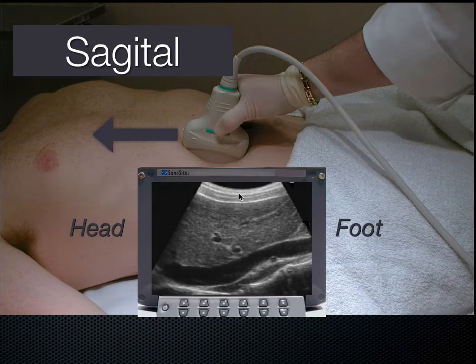As I go deeper or posterior into the body, I finally arrive at the inferior vena cava. It's located underneath the liver. And I can see this is blood draining towards the right atrium of the heart, which is up this way, though off the screen, and the blood is coming from the lower portions of the body down here. So the blood is actually traveling in this direction towards the head. Okay, sagittal plane. It means longitudinal when approached from the anterior location.